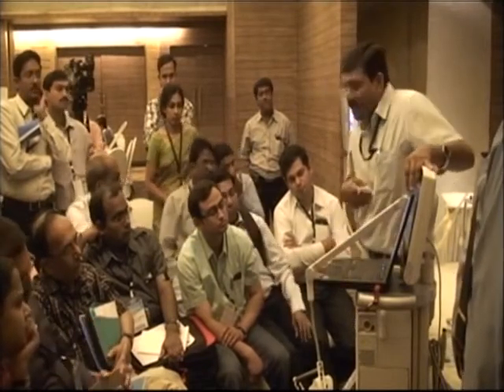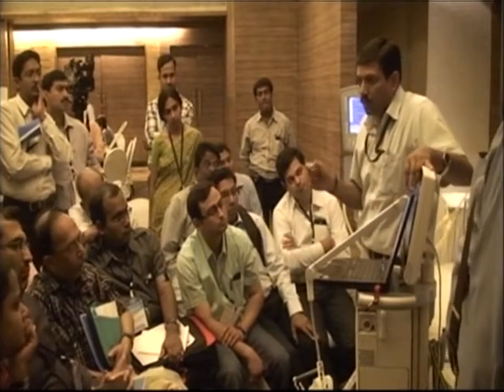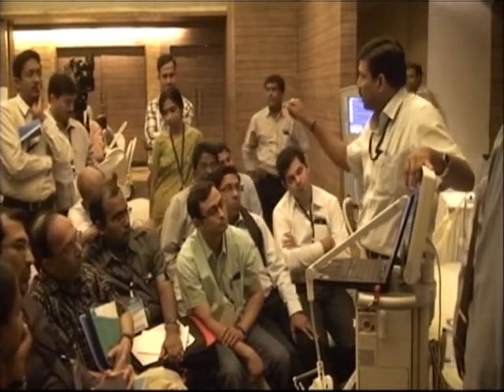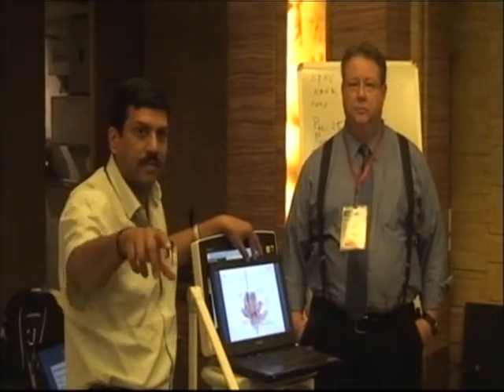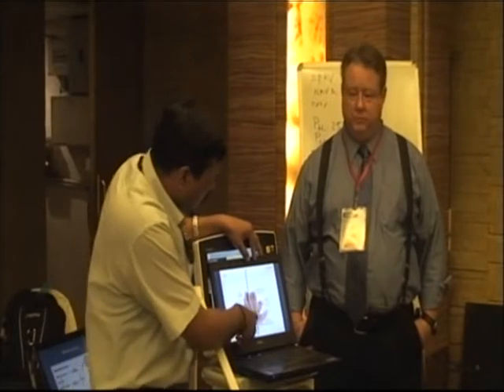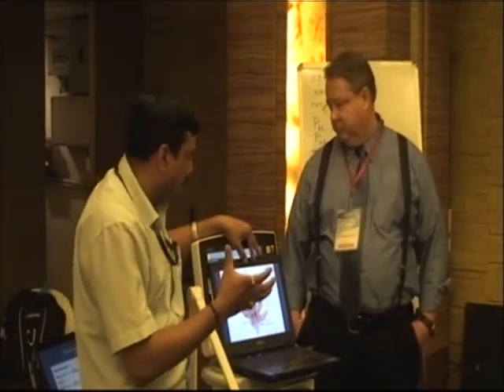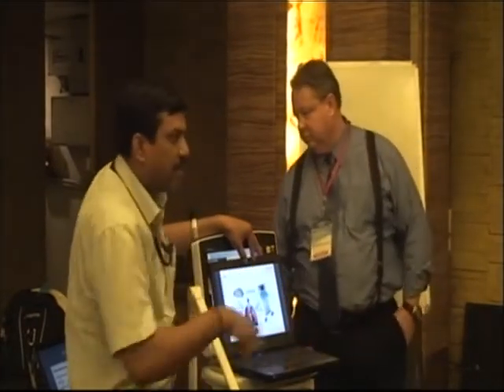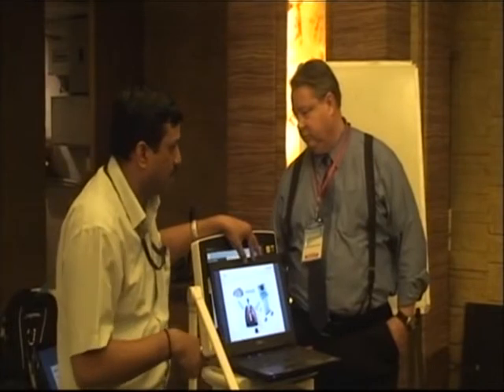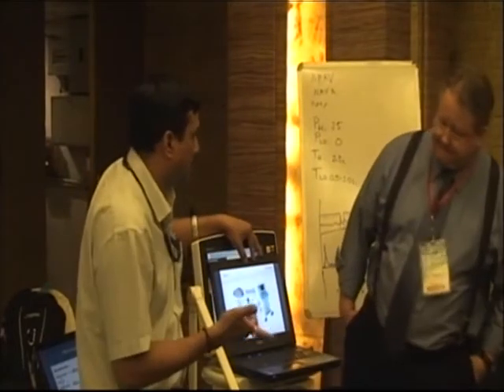So we put a catheter at the diaphragmatic level. The same catheter is used as a feeding tube also. We have sizes starting from 6 to 16 French. Right now we have an 8 French catheter with the size on it. There are electrodes over here which catch the electrical activity of the phrenic nerve, the electrical activity of the diaphragm. And these signals are given to the ventilator, and the ventilation is given to the patient according to the patient's need. Rather than us deciding the pressure support, the patient decides what pressure support he wants and when he wants it.